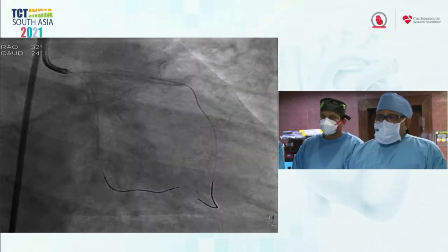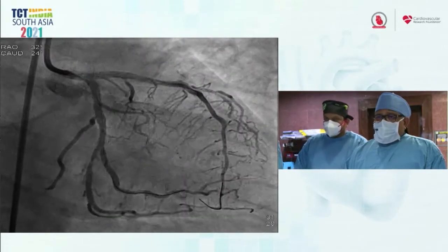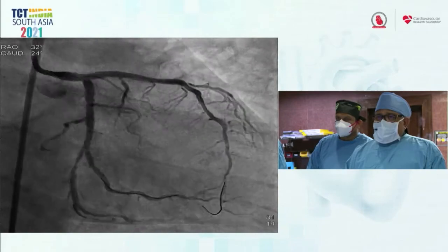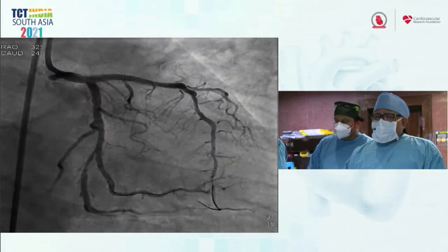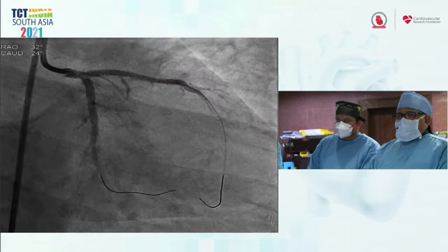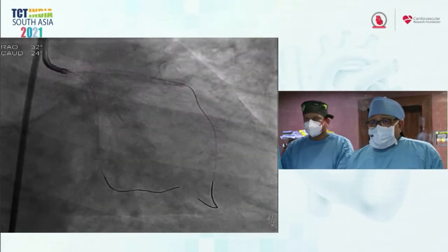So now the plan is to have the final IVUS across the LAD. As I had dilated with 2.5 across the LCX, a repeat kissing balloon has not been done across the left main. And IVUS imaging has to be done across left main to LAD to look for what the result is after having a balloon dilatation with 3 in the mid part, 3.5 proximal and 5 POT.